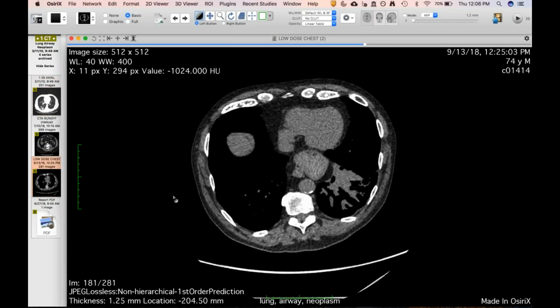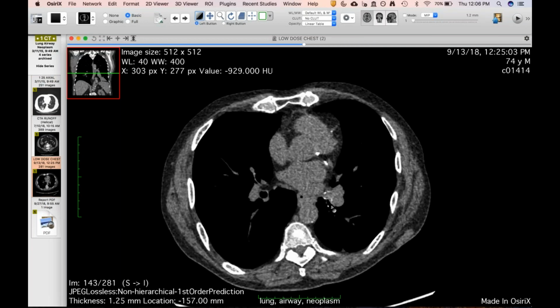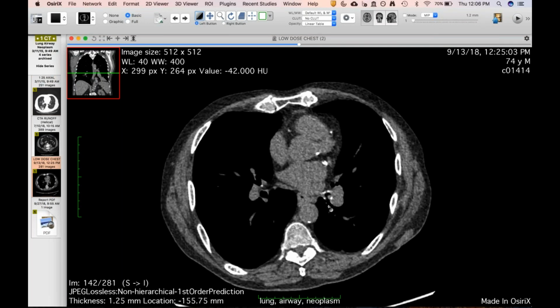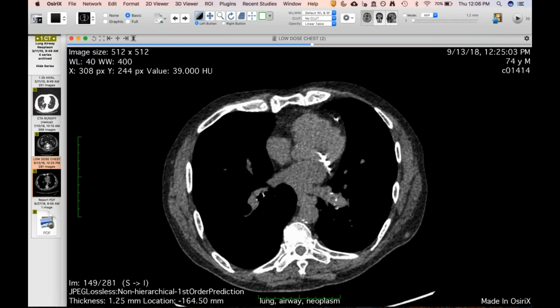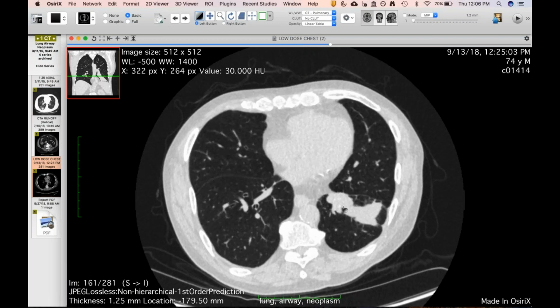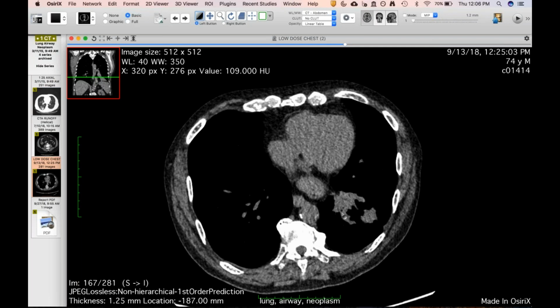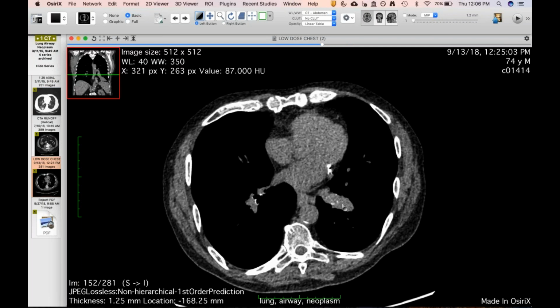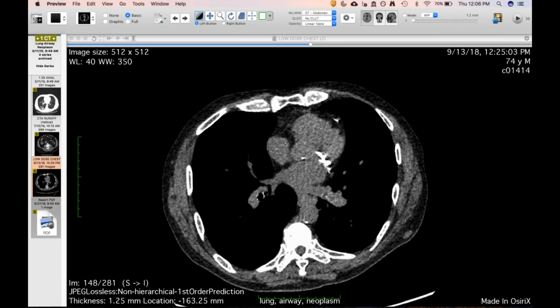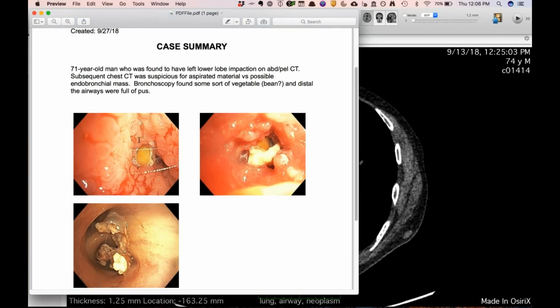So when they got the follow-up chest CT, my colleague Kim saw this. And unfortunately, we did this as a low dose, so you can't really see that much. But everybody was thinking cancer, but she correctly, astutely suggested that maybe this was just something aspirated, since he had the prior stuff in the right lower lobe, didn't really see a discrete mass, and there was that little lower attenuation focus on the abdomen pelvis CT. And so the pulmonologist just took him to bronch a couple days ago, and sure enough, there was no mass, but there was some sort of leguminous material.